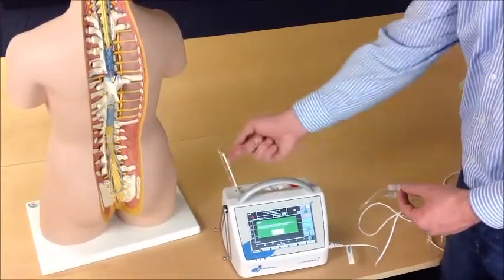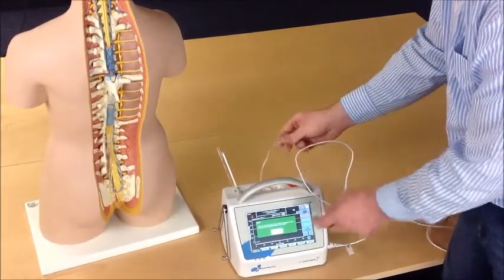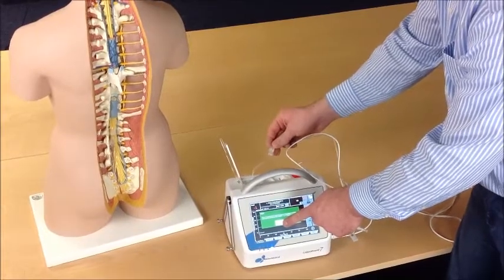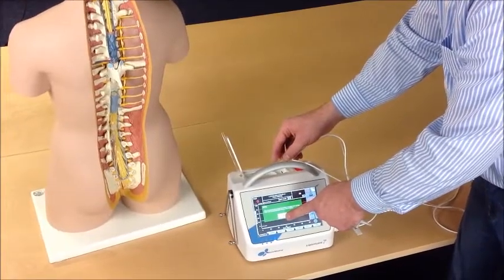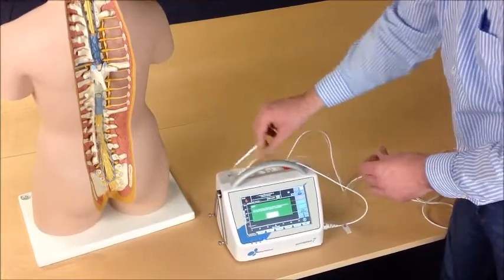In order to mount the tube set into the machine, open the cover clap, attach the first connector, press the button, and let the machine mount the tube set itself. Then close the cover clap.